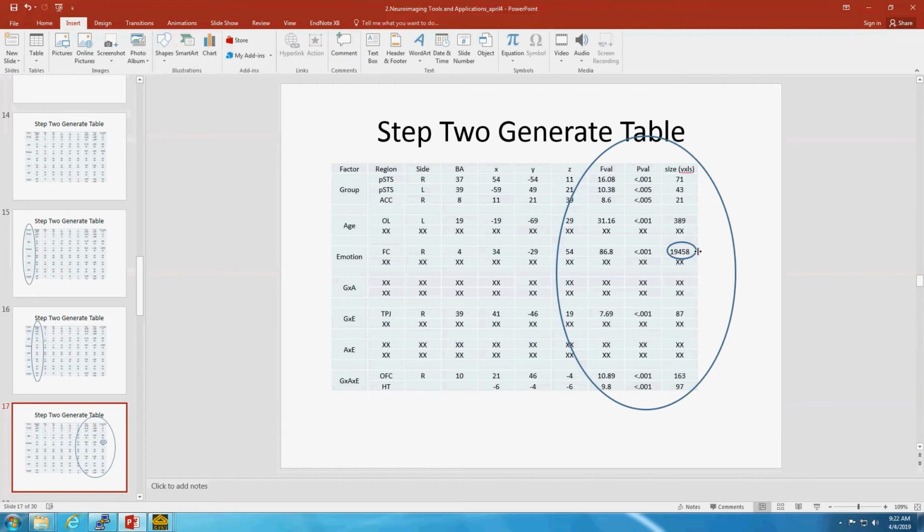One thing you run into sometimes is that because it's such a strong effect, things blend together, and you'll have a cluster that goes from the temporal lobe all the way up and covers the cingulate. You have to look out for that, because that's not going to be a single functional thing, and you would probably have to go in and cut that up somehow. That happened when I was looking through this data set. There's one area that's huge, like half the brain.